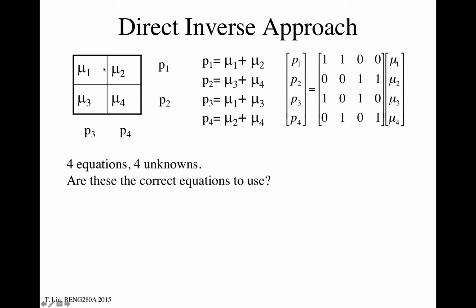In this case, it's a very low number of pixels, right? We just have 4 total pixels, 2 this way. And then across here, the integration gives me mu3 plus mu4. I don't know what they are yet, but what I do know is this value and this value, right? And then if I project down through the matrix vertically and get a projection P3, I know it's mu1 plus mu3, and I get a projection this way, and I know it's mu2 plus mu4. All right. So it's essentially a system of equations.